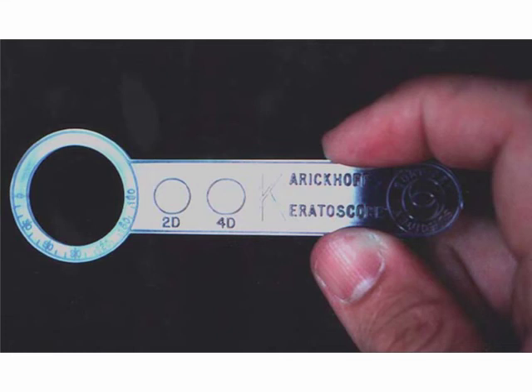The reason that I show this picture is this. You see that circle that's etched in it that says 2D and the one next to it that says 4D? Well, that 2D ring, that's what 2 diopters of cylinder looks like. Now, how round does that ring look? To me, that thing looks pretty round. If I were to see this, and you can even tilt your head to double check, I'd have a really hard time judging where the axis of that cylinder is. Okay, the 4 diopter one, I can recognize that that's ovoid.